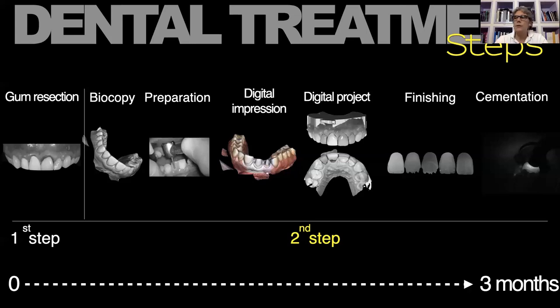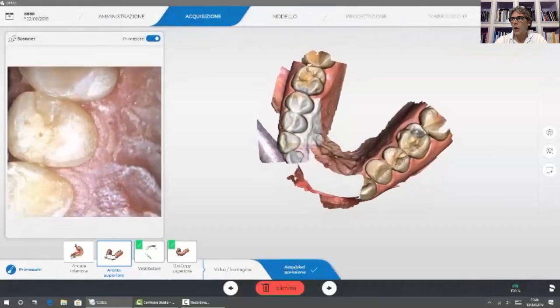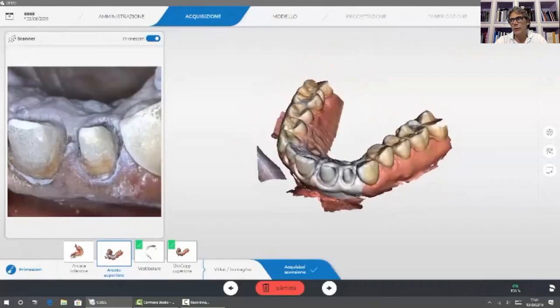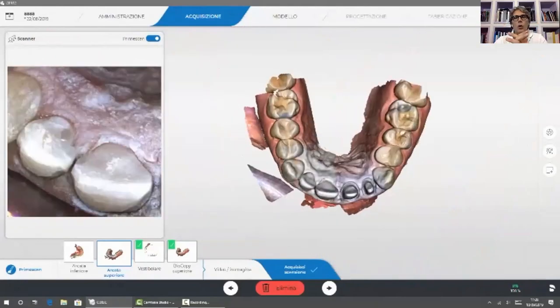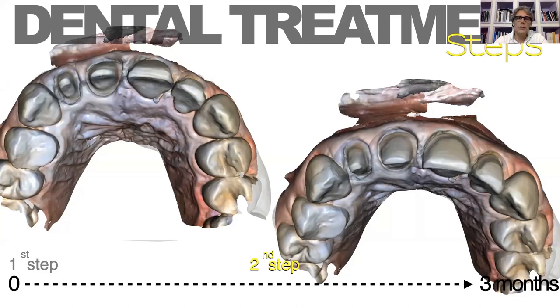In the next step, I came back to my scanner, to my Primescan, and after preparation, again, I took the last impression, scanning only the anterior areas and filling completely the model previously cut by the digital cutter, and the software will be able to match the two models, the first one previously cut and the second one with the teeth prepared, creating only one model after the matching. If you observe this model, the finishing line preparation is absolutely immediately and simply visible, and that allows you to better design the finishing line preparation also under the gum.